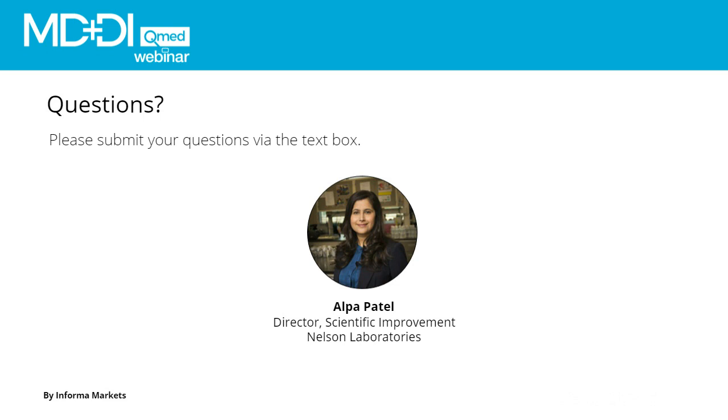Okay, good. Next question. How are non-critical devices defined? Non-critical devices are defined as devices that come in contact with intact skin only. So devices like blood pressure cuffs, or devices that are sitting in the clinical facility or OR room that is supporting critical features. If you think about robotic arms, the robot arms are critical devices, but the machinery that's holding the arms and moving them around is non-critical. So they will be validated differently than how a robotic device would be validated.